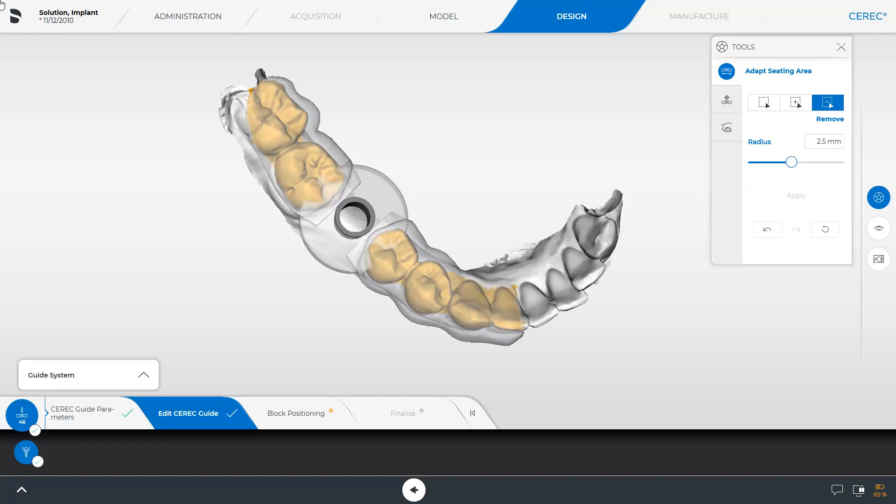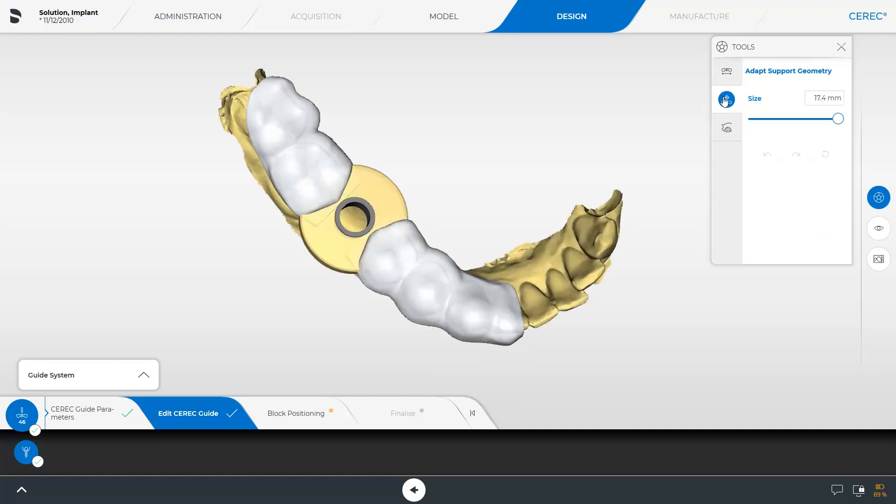Next we switch to the Adapt Support Geometry tool. The slider allows you to decrease or increase the support geometry radius.